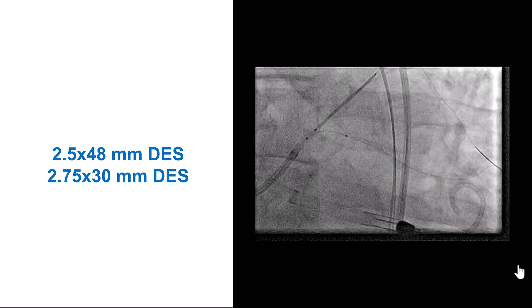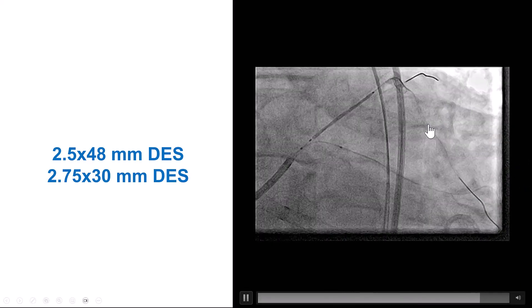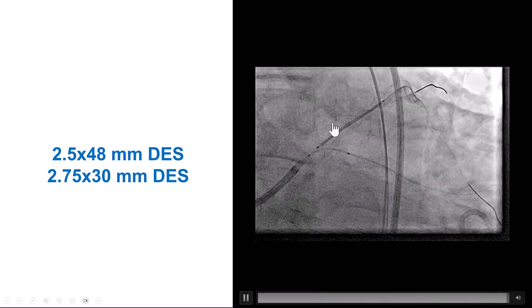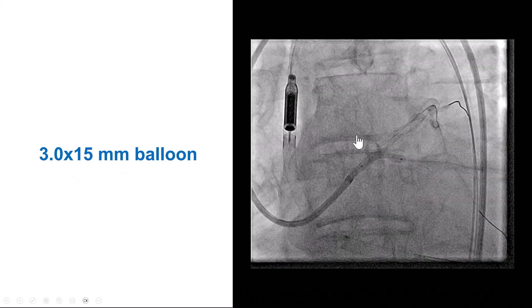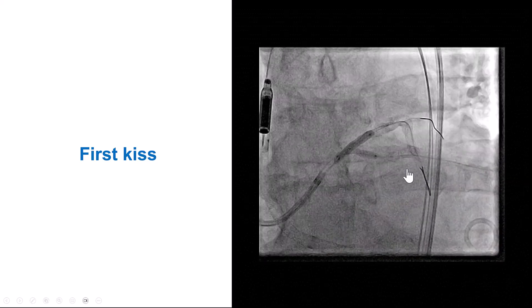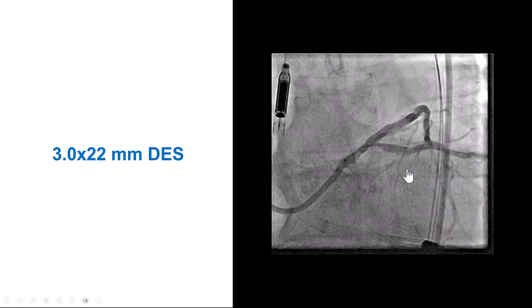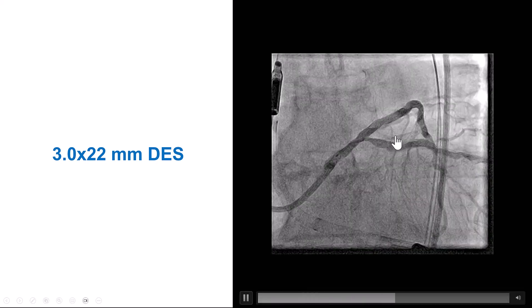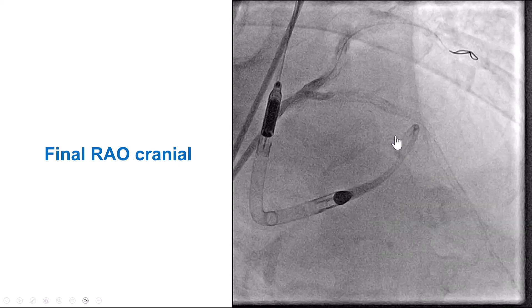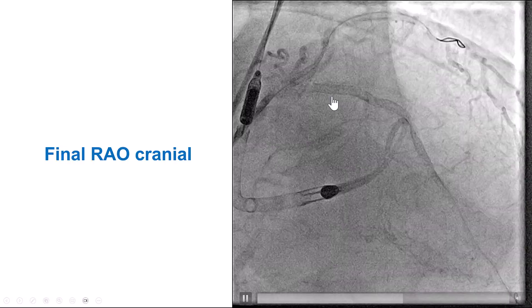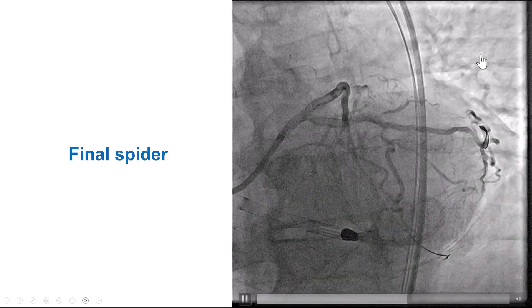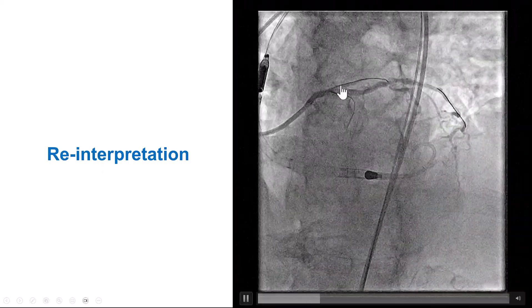We then pre-dilated and fortunately had good expansion without needing advanced lesion modification. We placed two stents in the LAD — one in the mid and one in the proximal. The plan was to perform DK crush because we needed to also treat the circumflex. We placed the stent in the LAD, crushed it, rewired, performed the first kissing balloon inflation as part of DK crush, then advanced another stent into the circumflex. After rewiring and the second kissing inflation, we had a nice result with TIMI 3 flow in both the LAD and the circumflex, confirmed on the spider view as well.